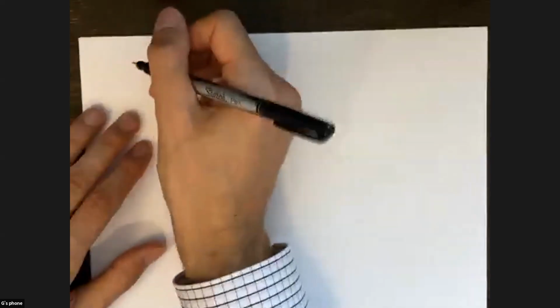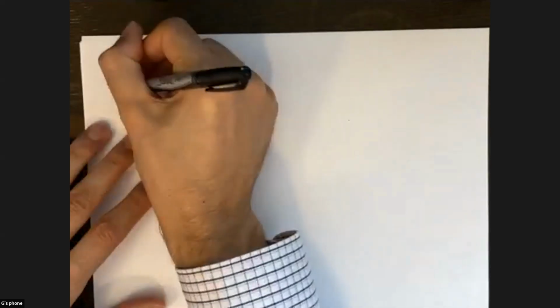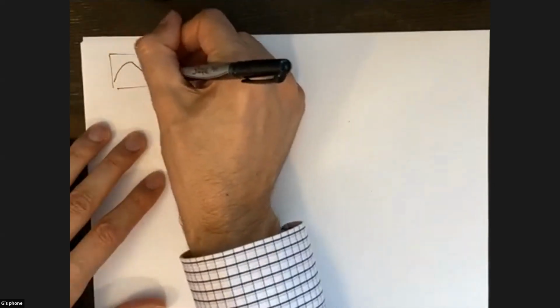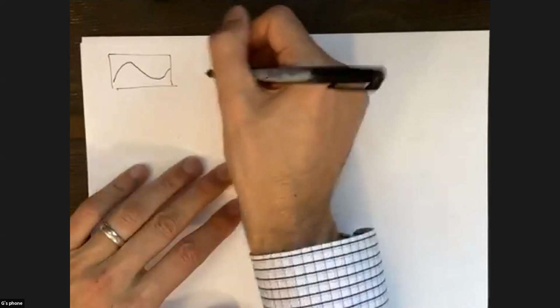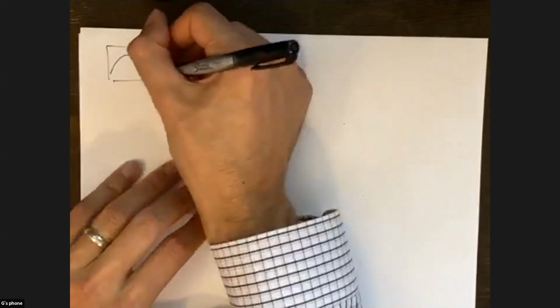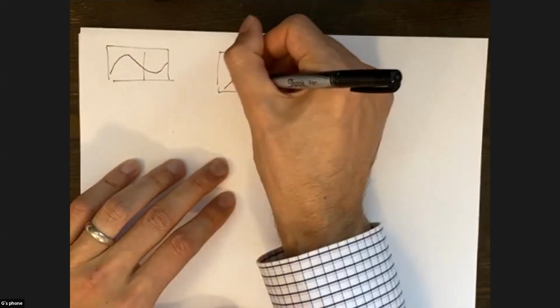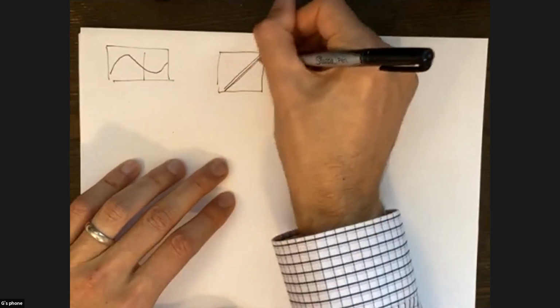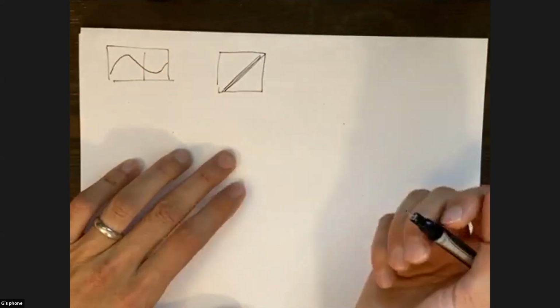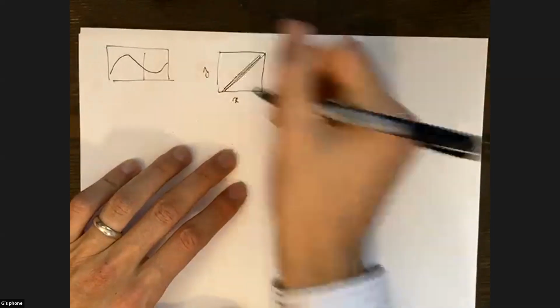So when we were doing back projection, if you remember, we had a sinogram, and what's going on is we were taking a projection here, and then we were back projecting the projection into the image domain. So if we look at what's happening in the frequency domain when we do that, so this is x, y, this is the image domain.